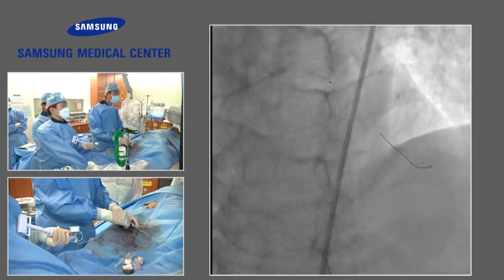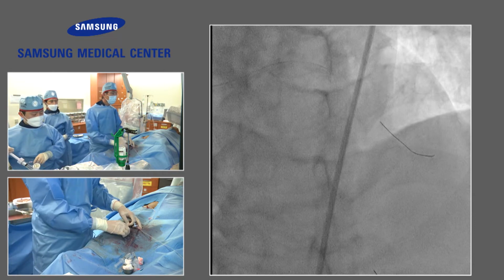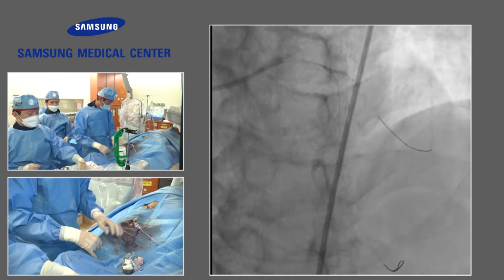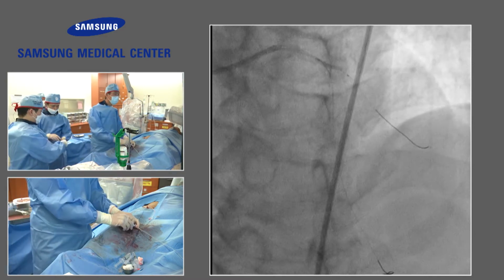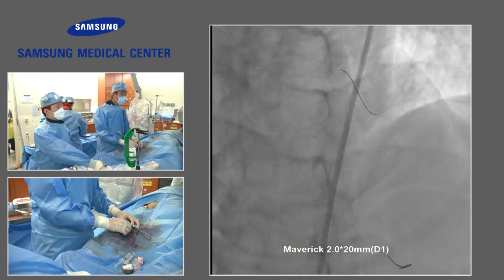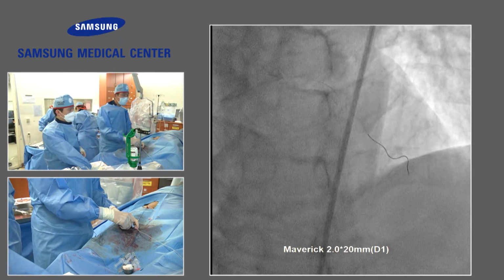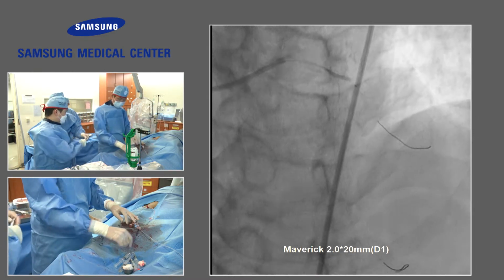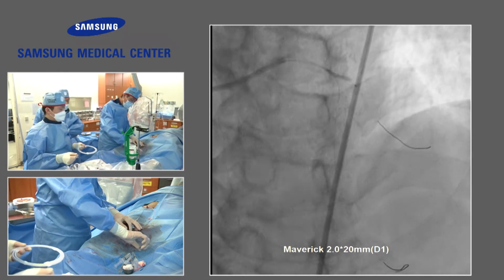If you can finish the whole procedure in a single long take, then we just maintain you alive. How long? Or we have to move to Jeonnam National University. Yeah, this is up to you. Okay, then 20 minutes past. Stent 2.75, 23. You can leave me anytime.